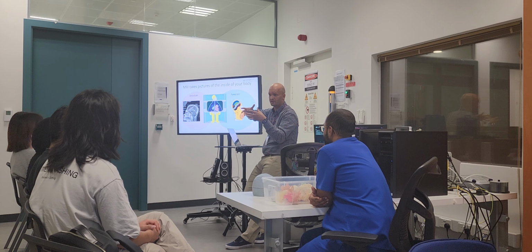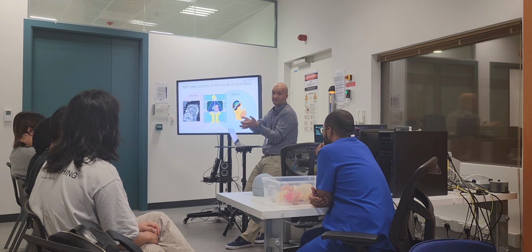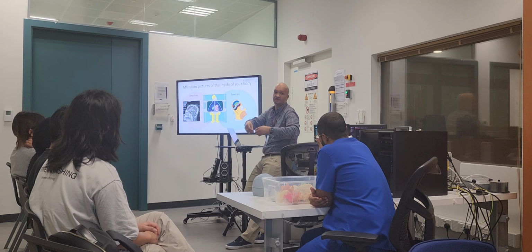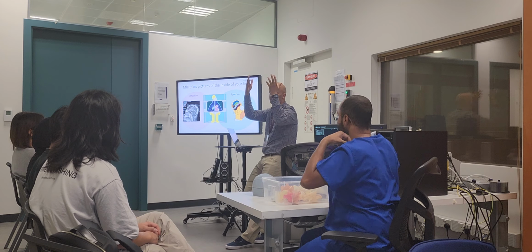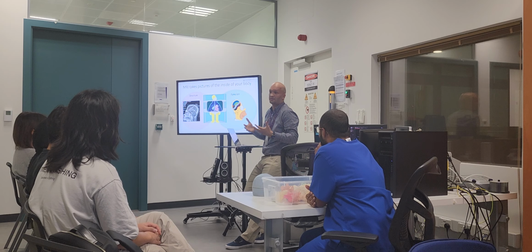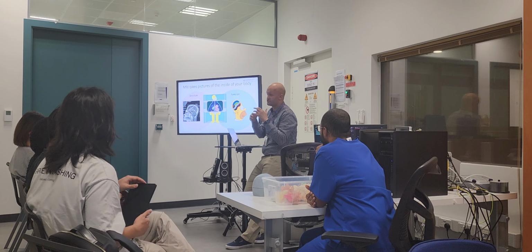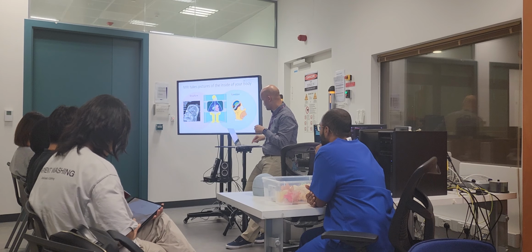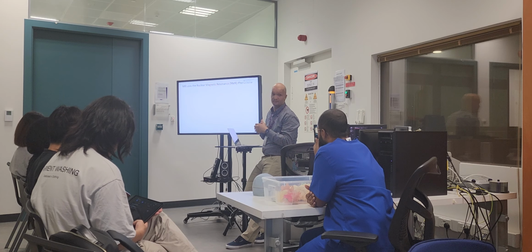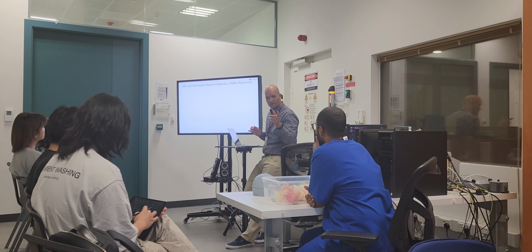It has a structure, a double helical fiber pattern, that makes it pump efficiently. The kidneys have a structure that filters the blood. The liver, similarly. All the organs in the body have a structure and a function, and MRI is just a camera, a tool that allows us to study the structure and the function together, and maybe start making some inference about the structural-functional relationship. So it's just a tool with a purpose. You're taking an NMR course now, right? This is an NMR course.